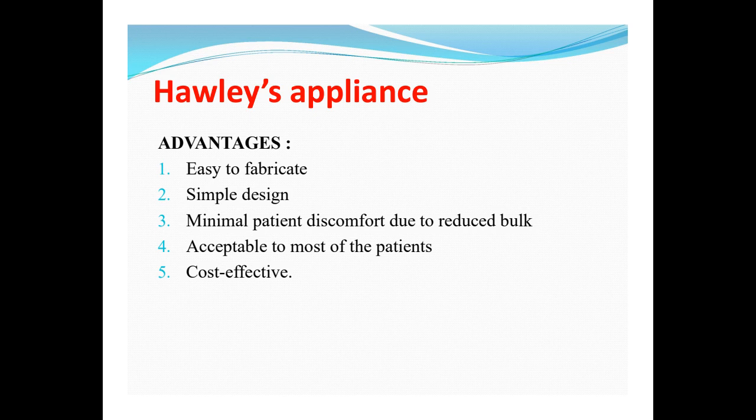So the advantages of this Hawley appliance is that it is very easy to fabricate, it is having a very simple design, it is causing minimal patient discomfort because of the simple design and the reduced bulk of the material. Most of the child patients accept this appliance very easily and it is very cost effective. So it is having many advantages.